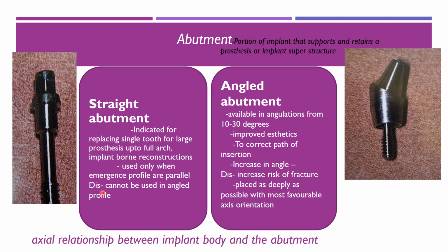The disadvantage is that it cannot be used in an angled profile, whereas this angled abutment is available in angulation. You can see that it is angulated. Mainly it is used for anteriors. So improved aesthetics and correction of path of insertion can be achieved. Increase in angulation means increase in angle. The disadvantage is increased risk of fracture, and it should be placed as deeply as possible with the most favorable axial orientation.